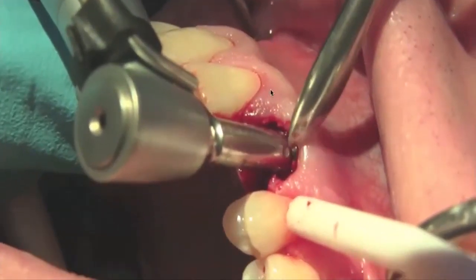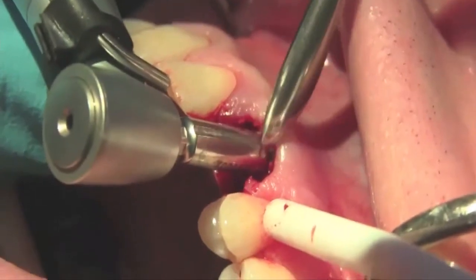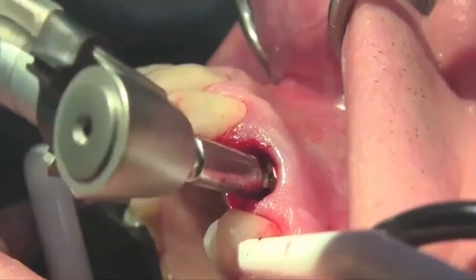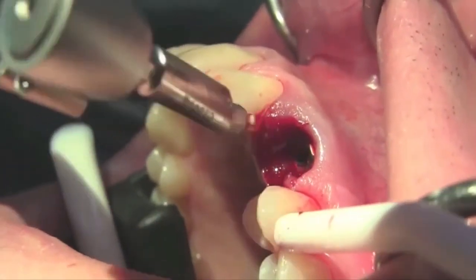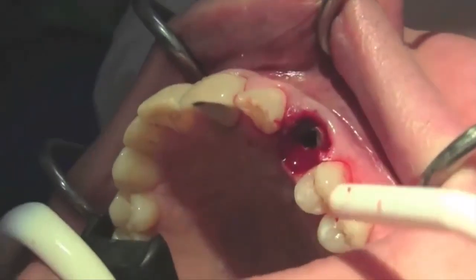At this point, we have a good positioning of the dots, but we have not reached the right depth, so we have to go a little bit deeper. I just wanted to make sure that you look at that. This implant is still too coronal.